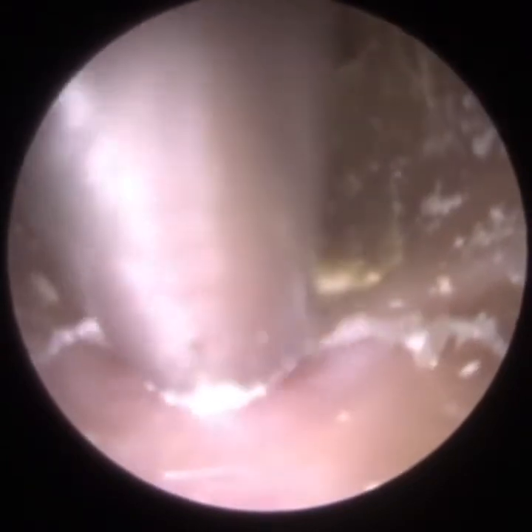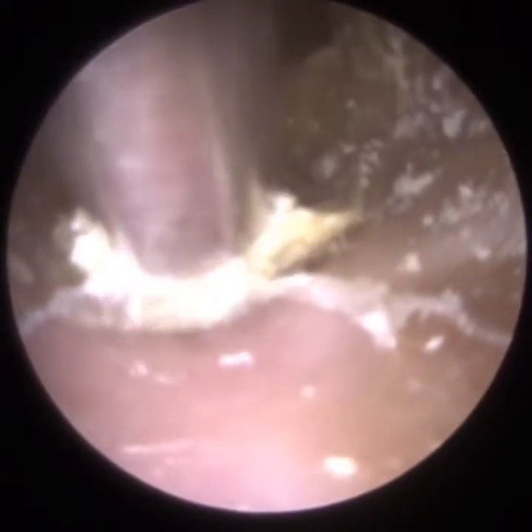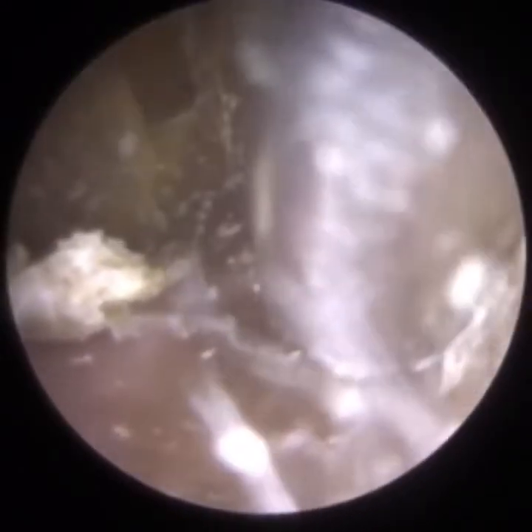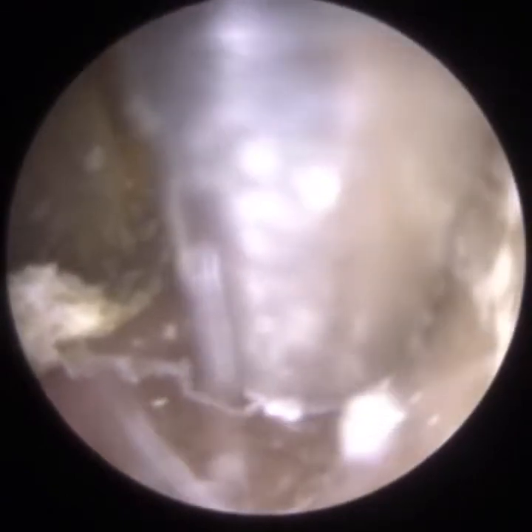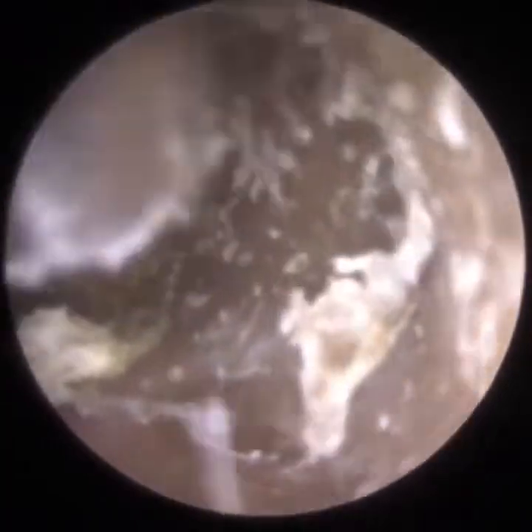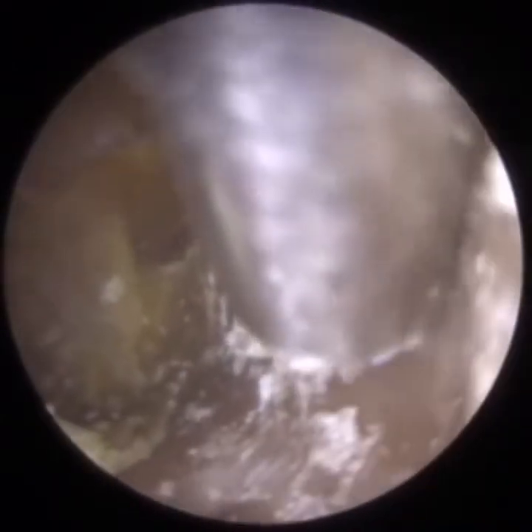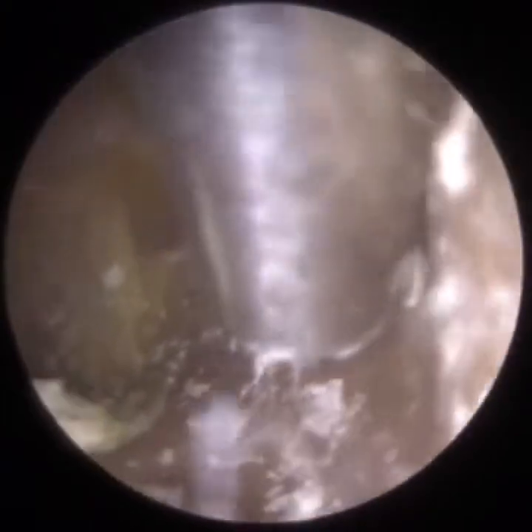Now, you can be forgiven for believing that this skin has got some fungal infection because you can see some spores, but that's not the case. The patient regularly uses antibiotic spray, and what the antibiotic spray does is almost crystallize the skin, so it prevents it from getting infected and wet and sticky. Now, if you wait till the left ear, the second ear, unfortunately, the patient hadn't been using the spray in that ear, and it caused the skin to get infected and damp. So you'll see the contrast.